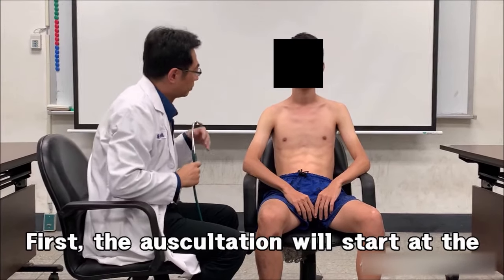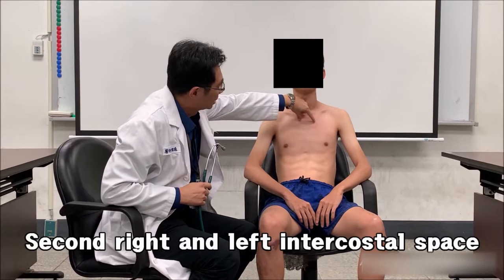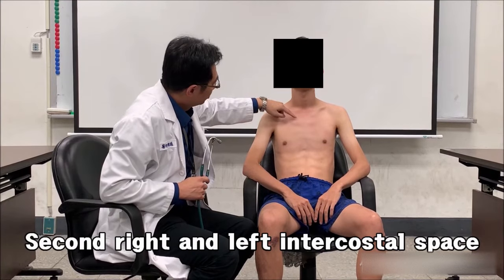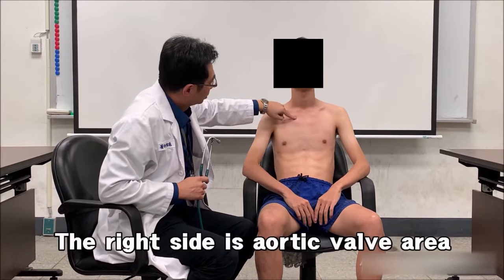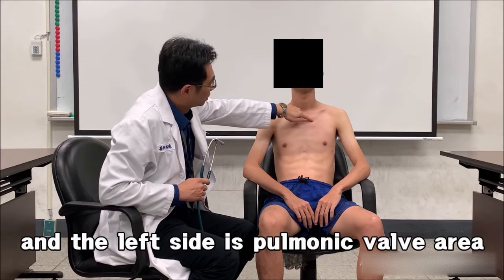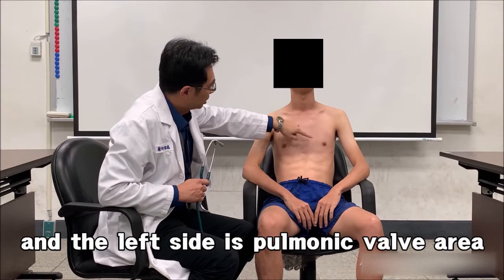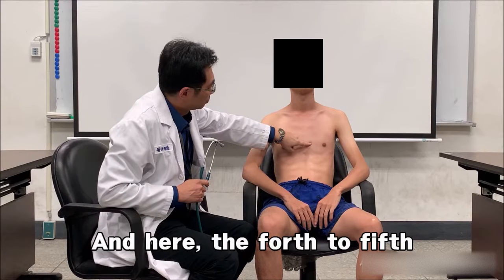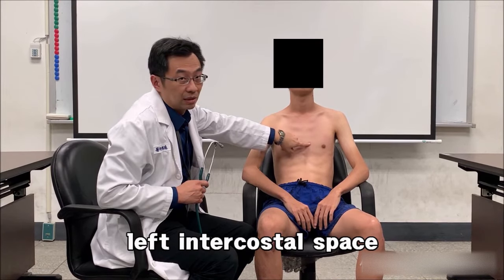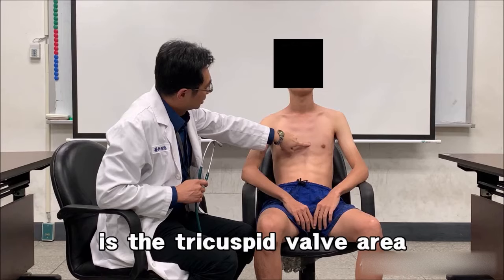First, the auscultation will start at the second right and left intercostal space. The right side is the aortic valve area, and the left side is the pulmonic valve area. And here, the fourth to fifth left intercostal space, is the tricuspid valve area.